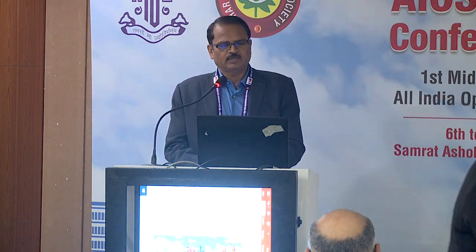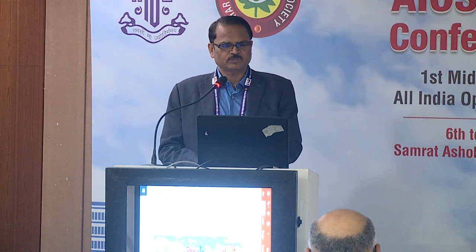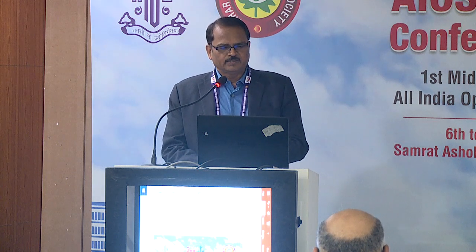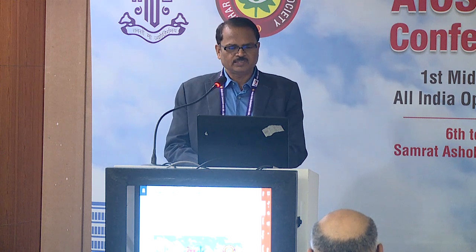There are so many causes of pre-existing PCR. We all know that posterior polar cataract can have it, but I won't discuss posterior polar cataract here. I would basically focus on trauma, that is more in open globe injury, pars plana vitrectomy procedure, post-intravitreal injection, and some of the congenital cataract.